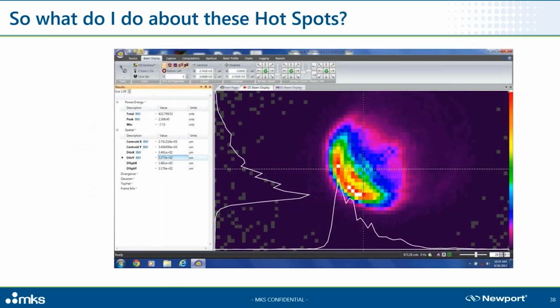Here's another example of a very peaky beam. Notice the middle just started to saturate. You can see the white spot starting to form in the red center. This is generally not good. So when this type of thing happens, you generally want to inspect and clean your optics, verify the alignment, scan through your Z distance and find focus, rotate the laser crystal, which is something internal to the laser. You might need to call your laser service technician for that.